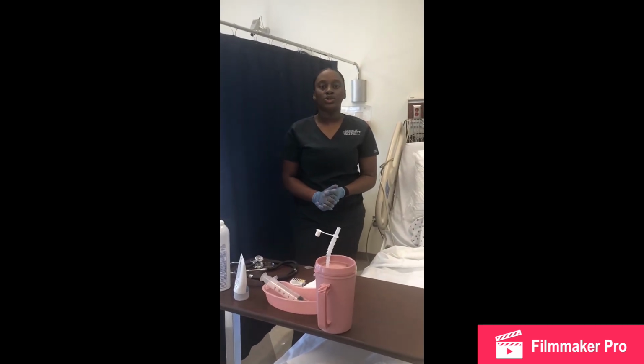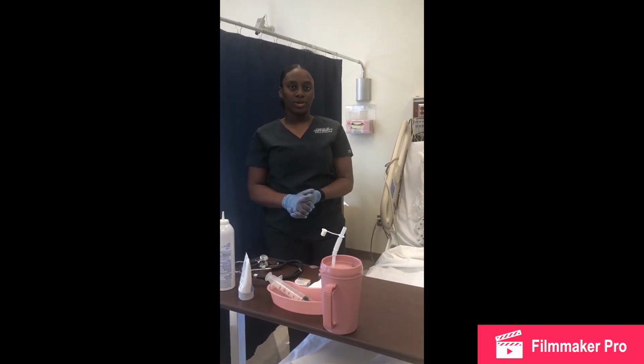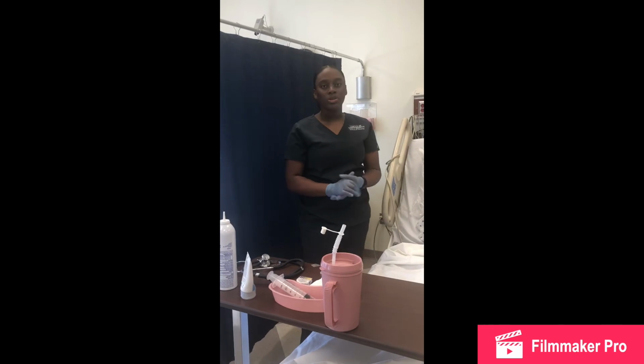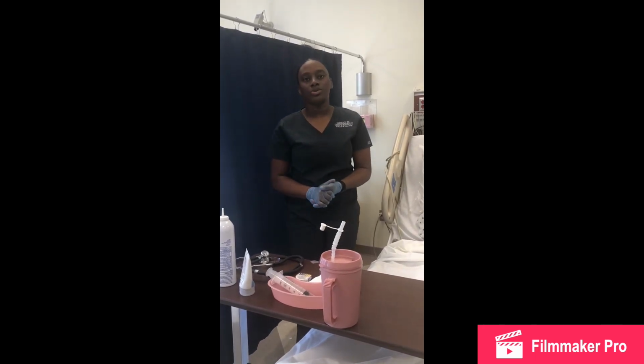After removing the NG tube, I would then document how my patient tolerated the procedure, document if my patient was in any pain or anything, document and describe the secretions that came out, the color, odor, and if they need any specimen sent to the lab, then I would do that also.